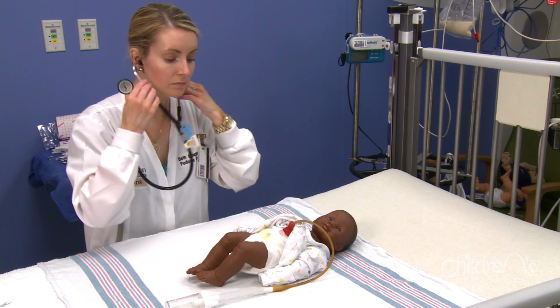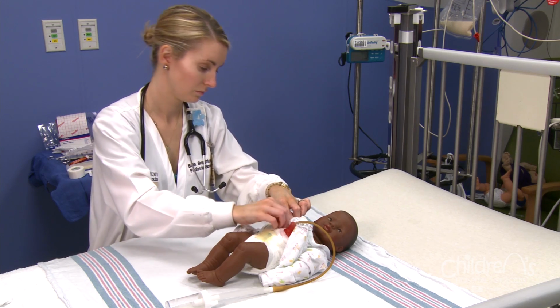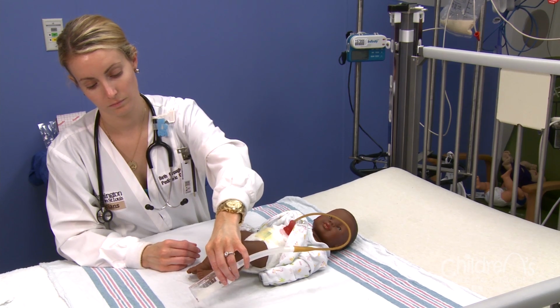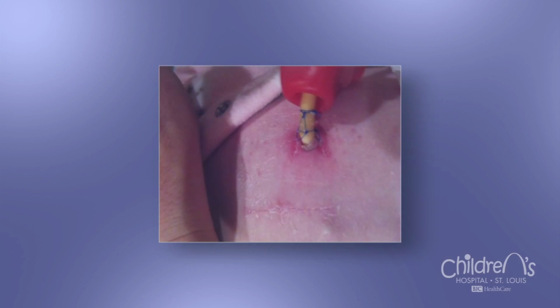The nurse will also check for heavy drainage around the gastrostomy appliance and will monitor the amount of fluid draining from your child's stomach. Once the surgical team determines your child is ready, the container will be disconnected from the G-tube. You may notice sutures or stitches around your child's gastrostomy appliance. These are used to anchor the appliance to your child's skin.